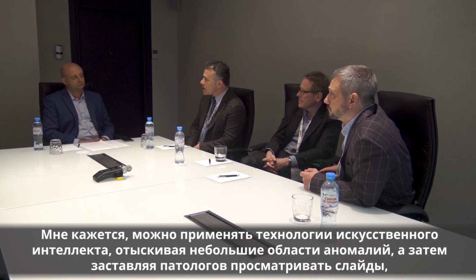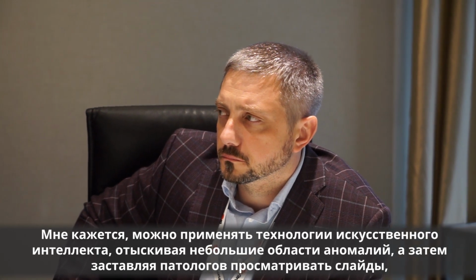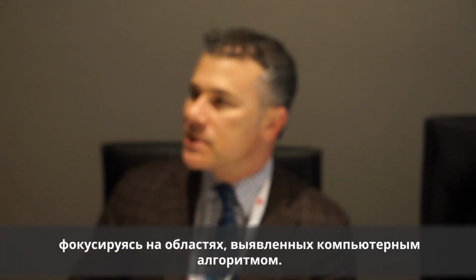I think another application will be scanning prostate needle biopsies. I think that's a very easy application of artificial intelligence, looking for small areas of abnormality and then having the pathologist review the slides, focusing on the areas that the computer algorithm has identified. So I think those are two. Screening. Yes, as screening tools, not to replace diagnosis, but to save time and to really assist the pathologist to use their time more efficiently, to look at more challenging cases where it's not as routine or mundane.